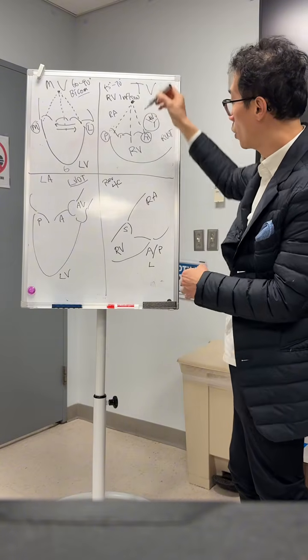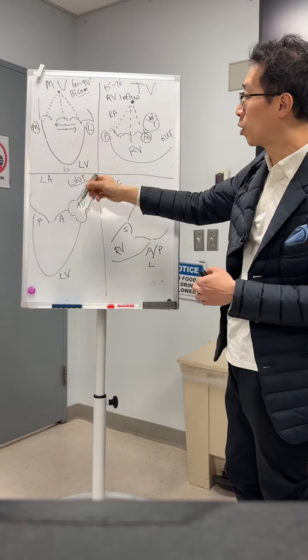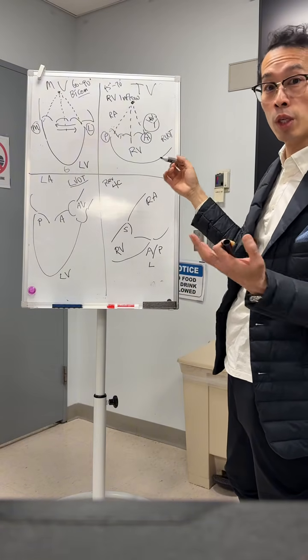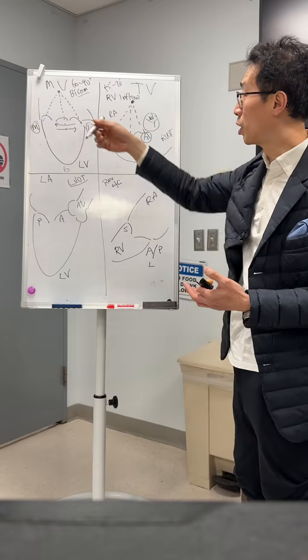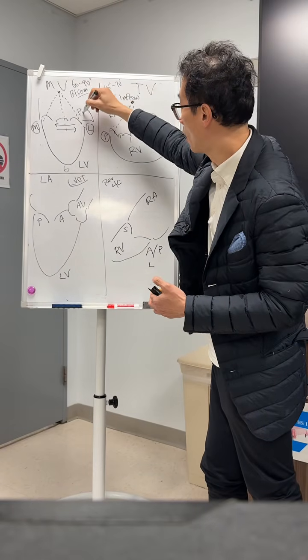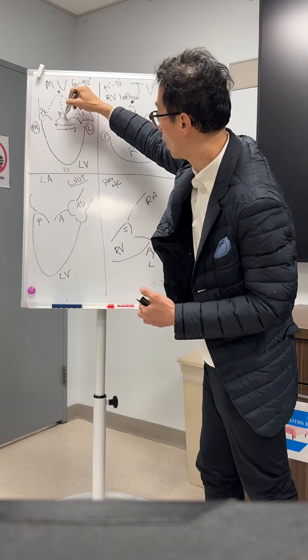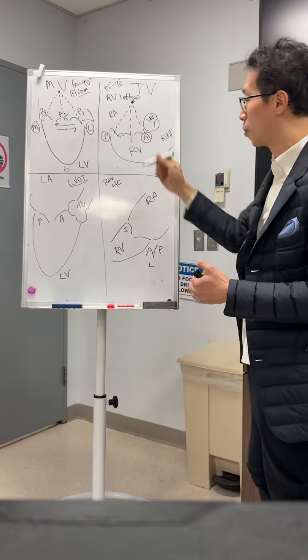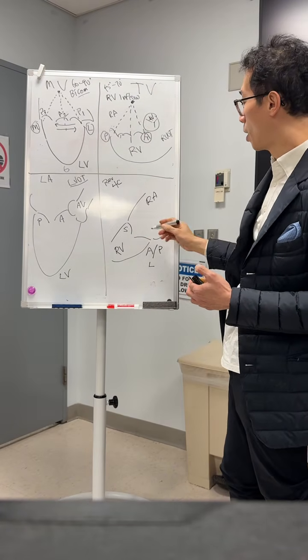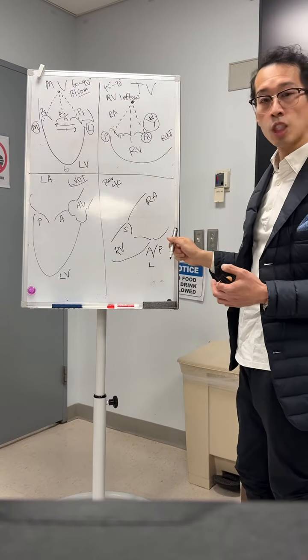So that's why when you do the X-plane, you need to see where the beam is happening. You know, unlike mitral, which is pretty much the entire segment is posterior, you just need to figure where it's P1, P2, or P3 to be able to delineate that, right? So, you know, this side will be more P1, this is P3, and of course this will be a classic A2, right? P1, A2, P3. Depends how it cuts across the mitral valve. So the same thing here, and so that's why you need to look at this, but it's very similar.